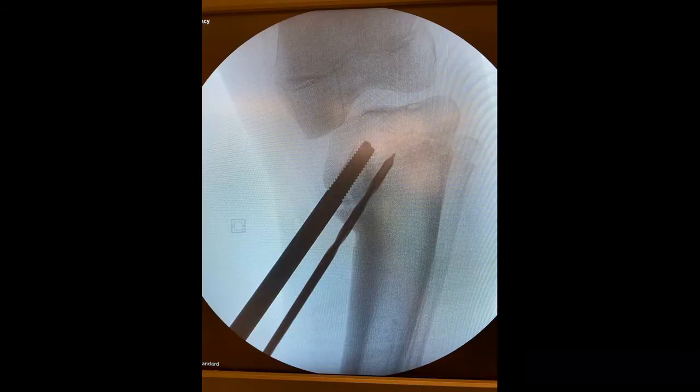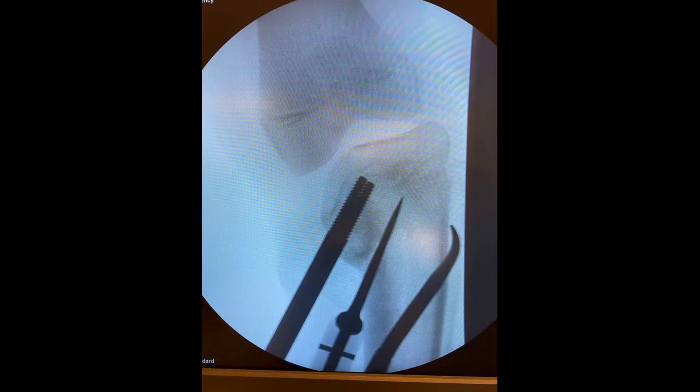We perform the first osteotomy, initially with drill perforations and then with an osteotome. The direction of the osteotomy is from medial to proximal and lateral, towards the lateral tibial spine.